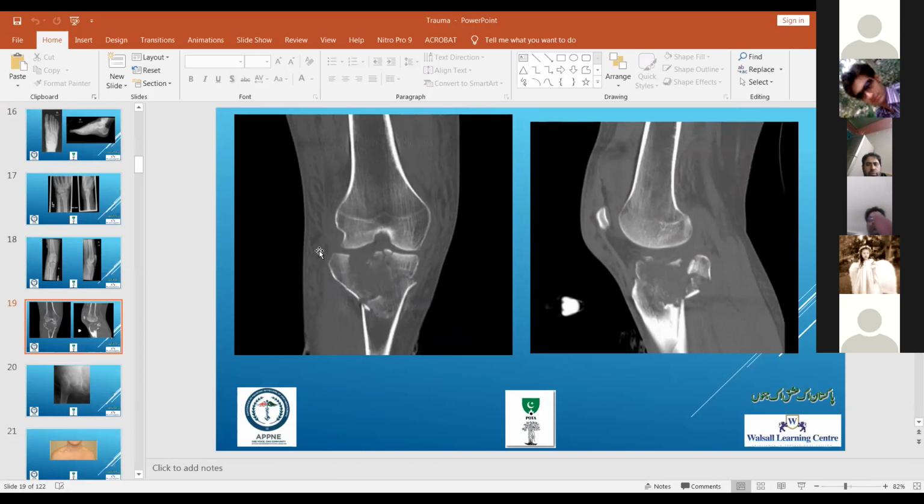Okay. I'm not sure about Pakistan, but in England, not everybody can put on Ilizarov frames. Not many people can do it. There are only special centers that do it, and therefore, in a patient like this, we have to send them. So when I worked near Birmingham, we had to send them to the QE, and there are 3 people who do fixators for us. Okay. Sir, in our setup, we apply uniplanar external fixators, and later on we reconstruct.